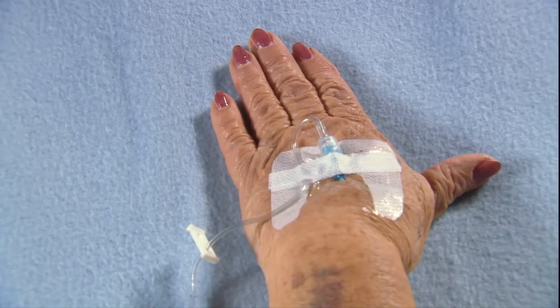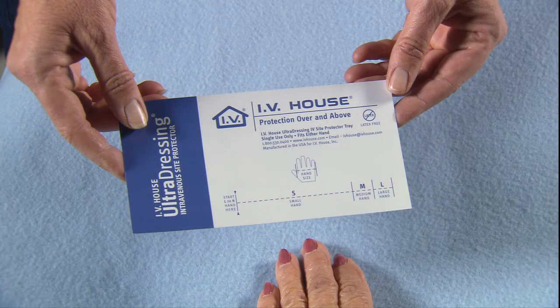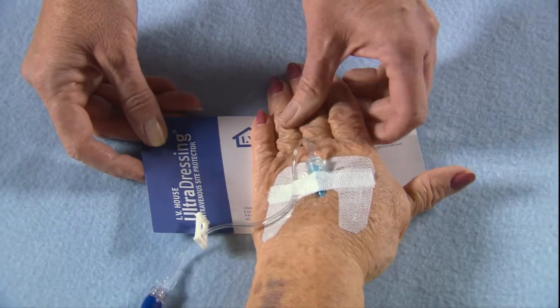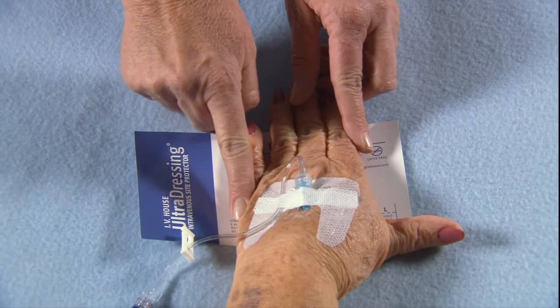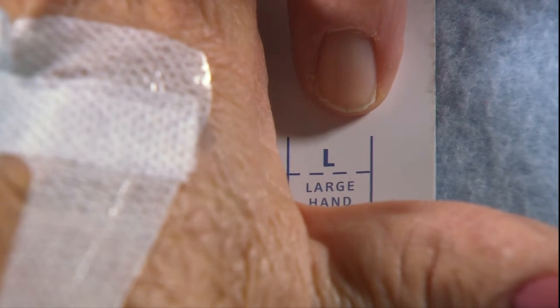The IV House Ultra-Dressing 730 series can be applied to any IV site on either hand or arm. To determine whether to use a small, medium, or large size, simply place the patient's hand on the left margin of the size chart and measure from the proximal interphalangeal joint of the first and fourth finger, knuckle to knuckle. This will indicate the correct size.